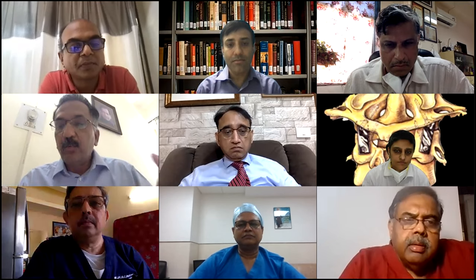What is your question, Dr. Behari? I didn't get your question. No, the question is, would you like to drill the end plates when you are doing a discectomy, because you know you said that graft subsidence can occur with an expandable cage also.